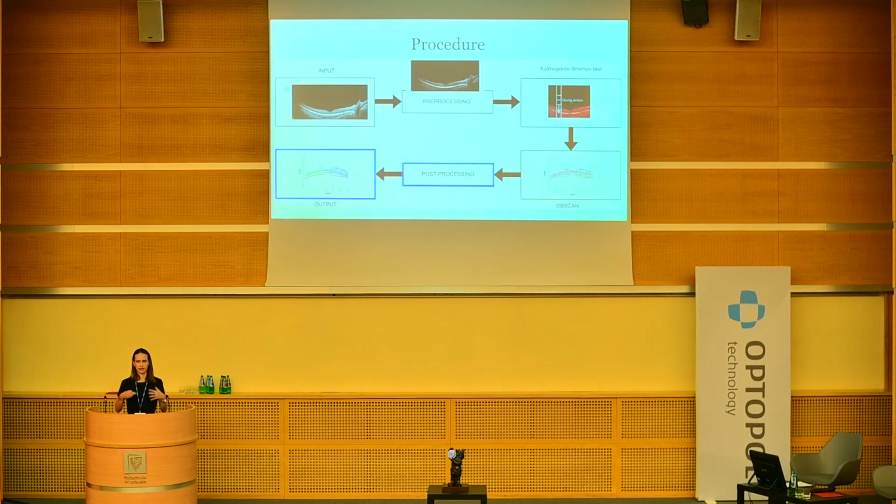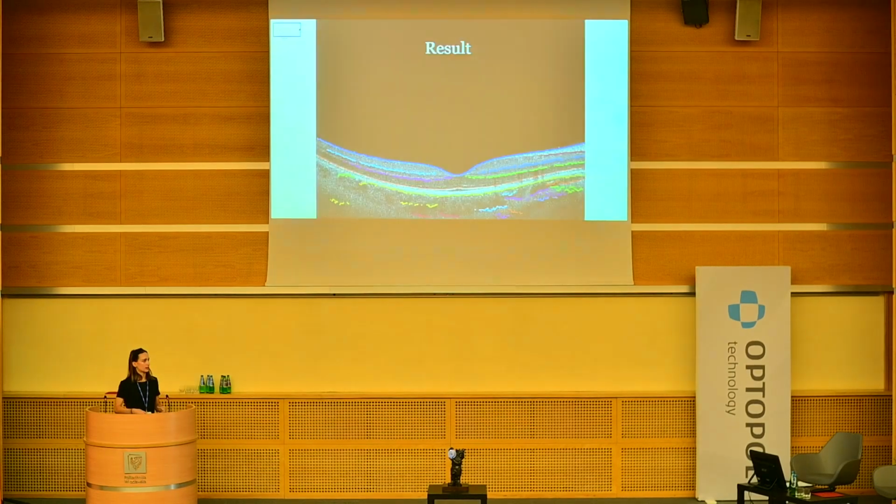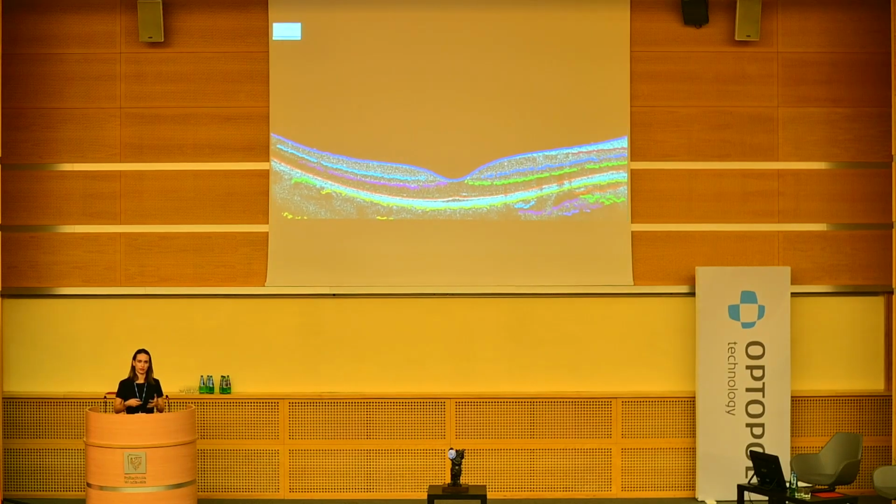And with that idea of connecting the subgroups to form the layers, the result of the algorithm can be shown. That is the illustrative result of the retinal layer segmentation algorithm on an average retinal B-scan. And at this point, as it comes to the prospects of further work, of course, the prospects include the optimization of steps of the algorithm, testing other databases, performing statistical analysis, etc.